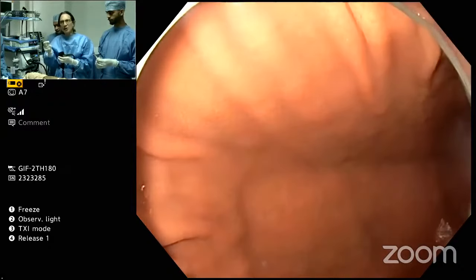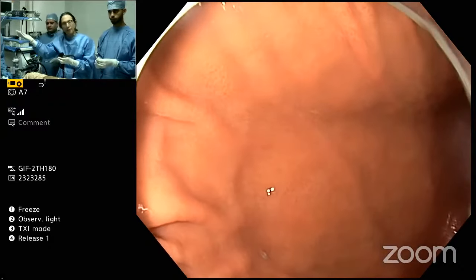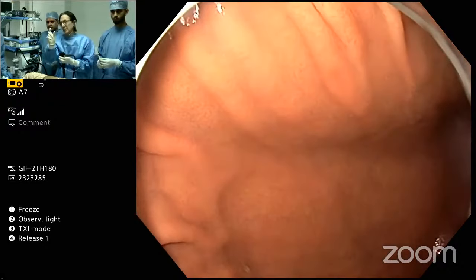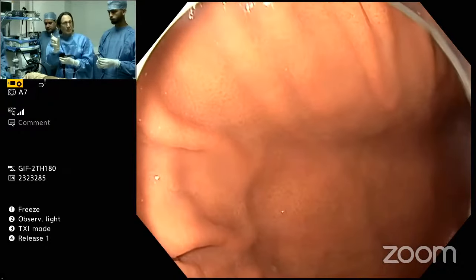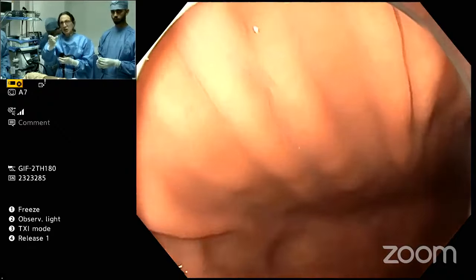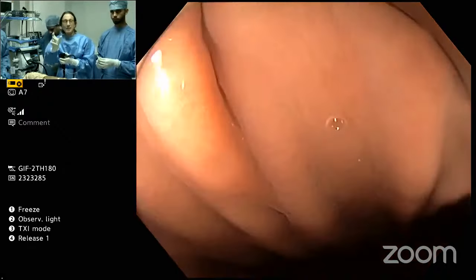Imagine we only had one clip still, but today we have a variety of different clips. Clips have evolved enormously. We have clips that have longer distances between the prongs. We have clips with different kinds of teeth, right? So Boston Scientific has the Mantis clip.